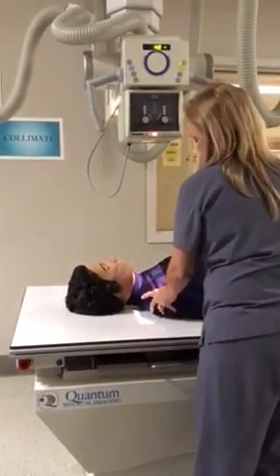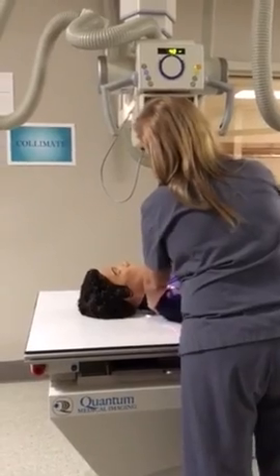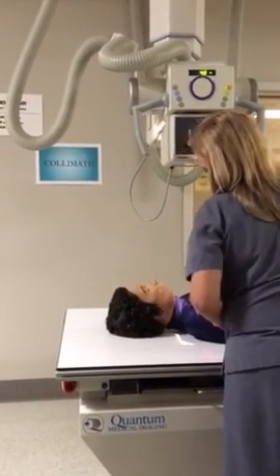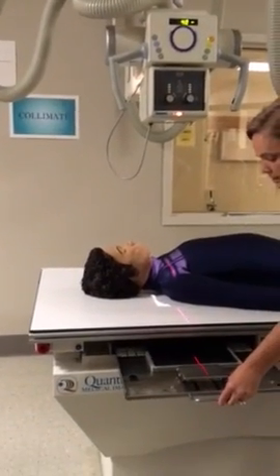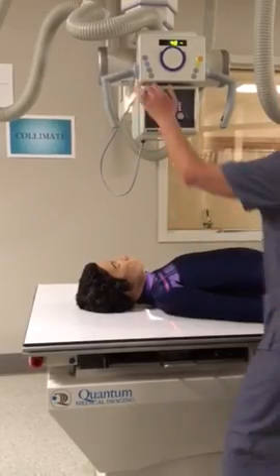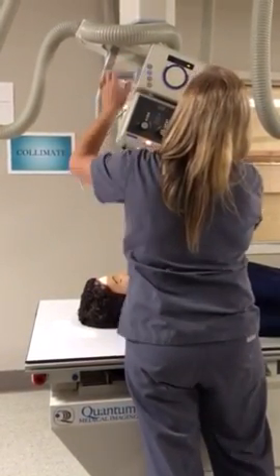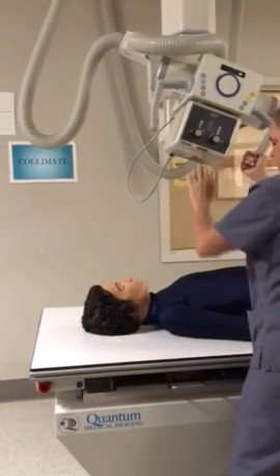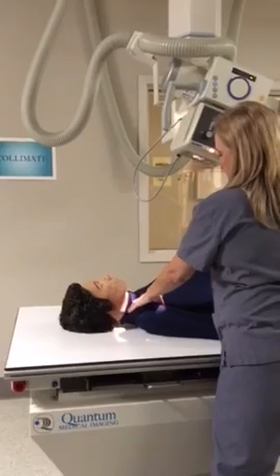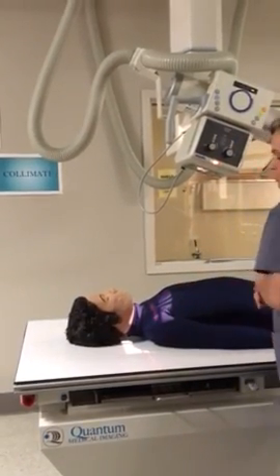Alright, so clavicle. The midshaft. Okay, that's AP. Alright, AP axial's what? 15 to 30, more for smaller patients. Okay, so that's your AP axial.